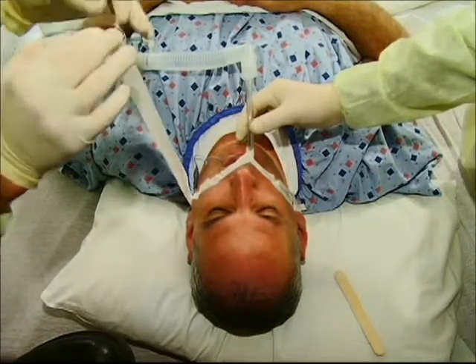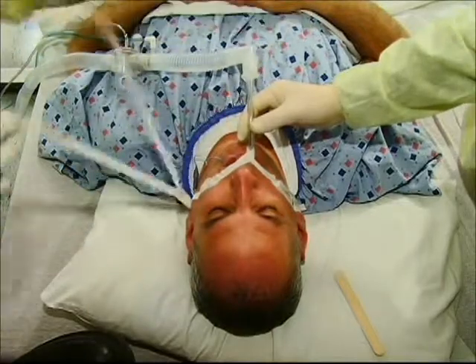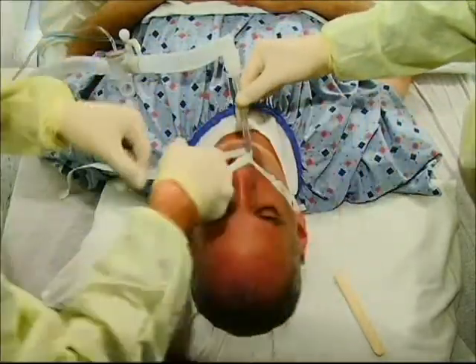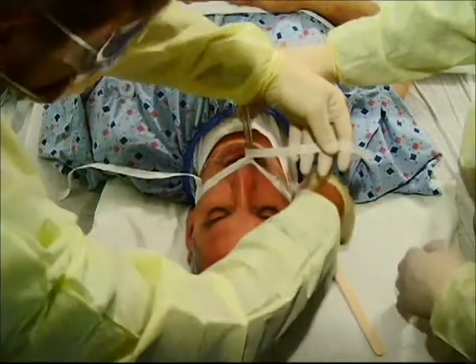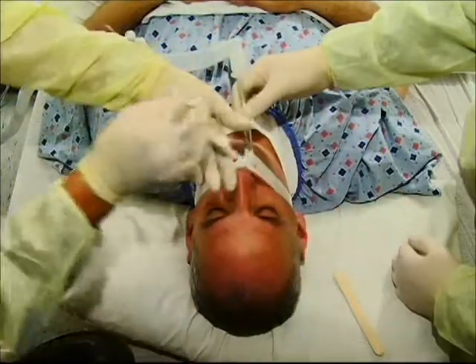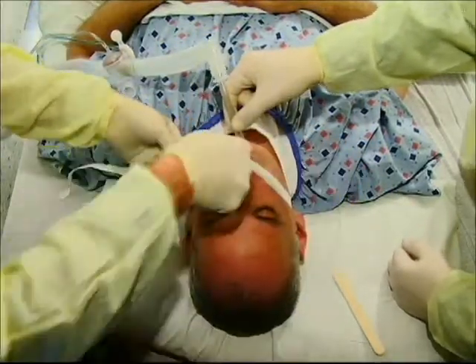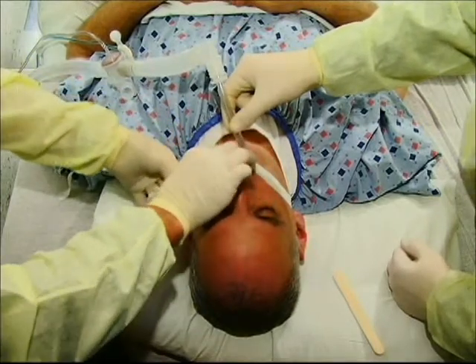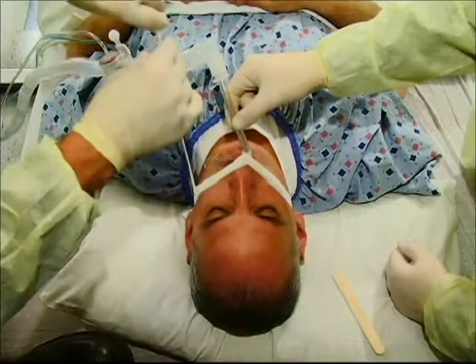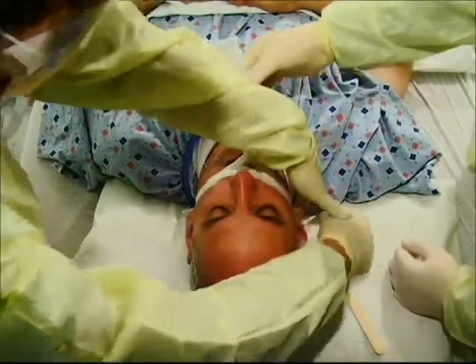Repeat the previous steps, alternating sides, until three of the four strips of tape created by tearing the original piece of tape have been wrapped around the tube and secured. It is vital that the tape be properly adhered along the upper lip. Use the last strip of tape to anchor the three pieces securely along the upper lip. Finally, it is important the tape is not wrapped too tightly around the patient's neck, thus impeding circulation. One finger must be able to slip under the non-sticky center section of the tape beneath the back of the patient's neck.